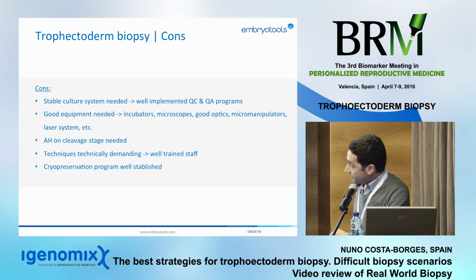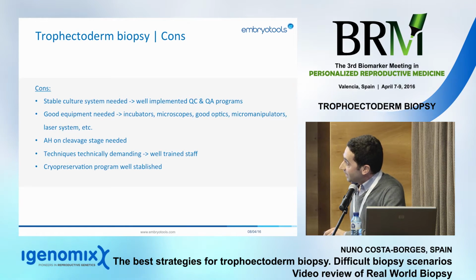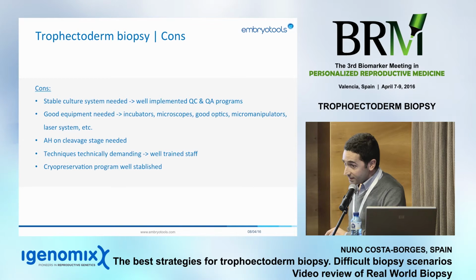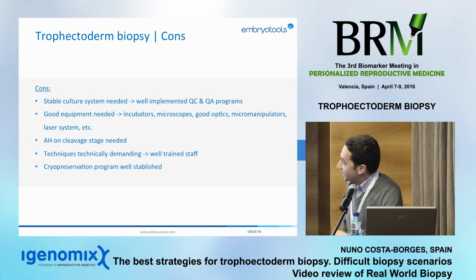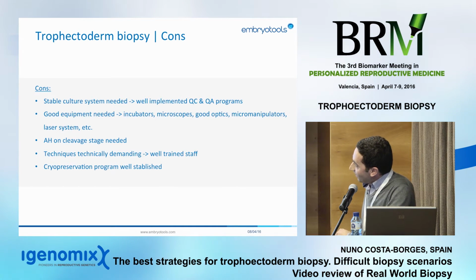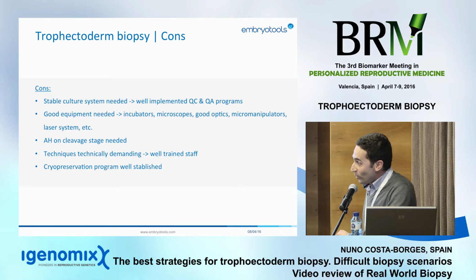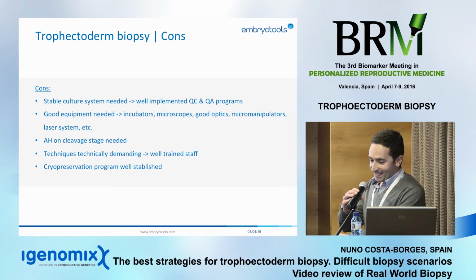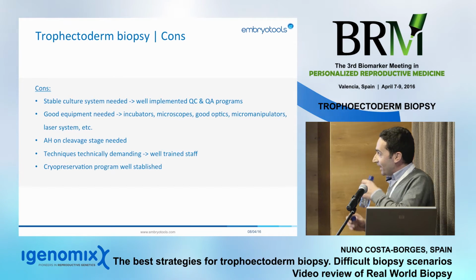The disadvantage of this technique, well, we have to consider that to have good blastocysts, we need a very stable culture system, and for ensuring that we have a stable culture system, we need well implemented quality control and quality assurance programs, and Gloria will talk about this after the coffee break.